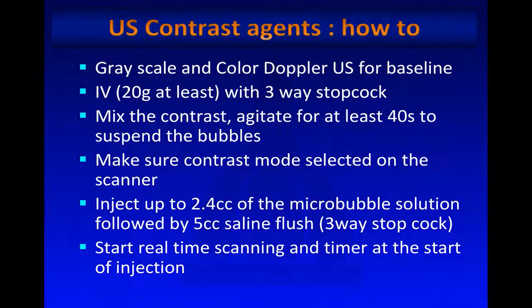Ideally, you want at least a 20 gauge needle, and you need a 3-way stop attachment. And I'll show you why in a second. And what you do is you mix the contrast, and you agitate it for at least 40 seconds to resuspend the bubbles. You make sure the contrast mode is selected on the scanner, and you inject up to 2.4 cc of the microbubble solution. And because that's a very small amount, you follow it by a 5 cc saline flush.